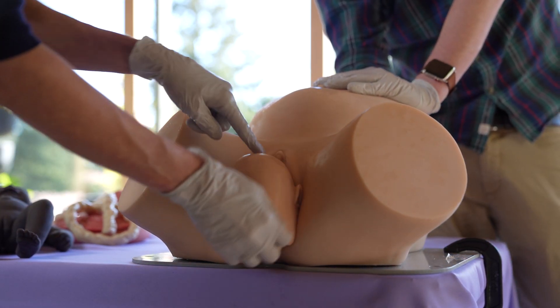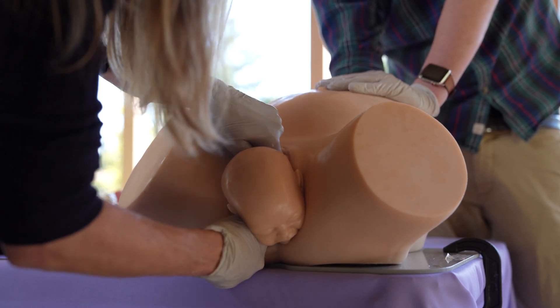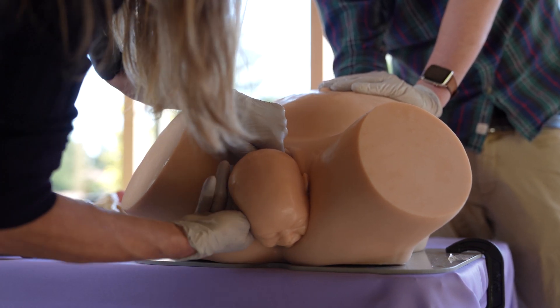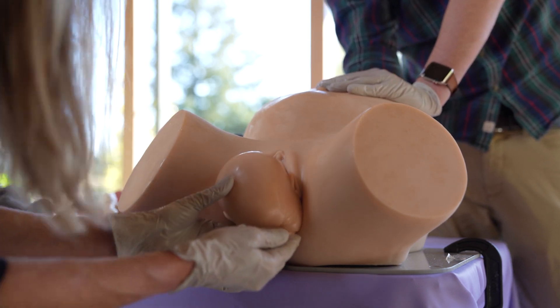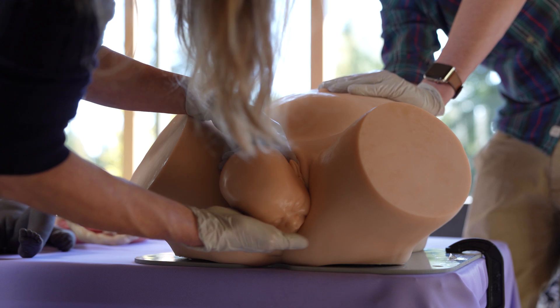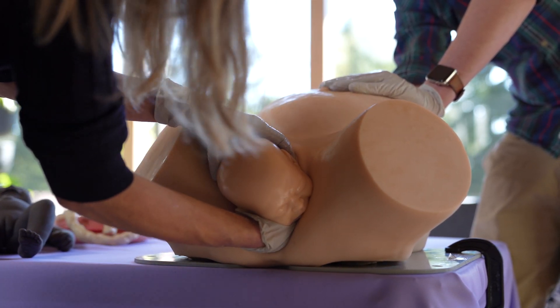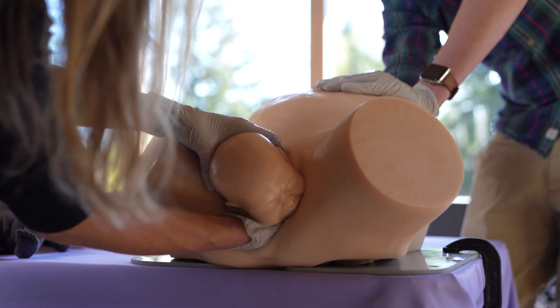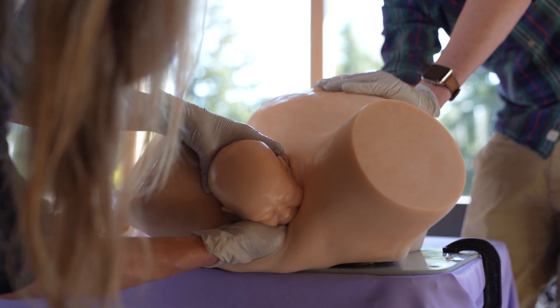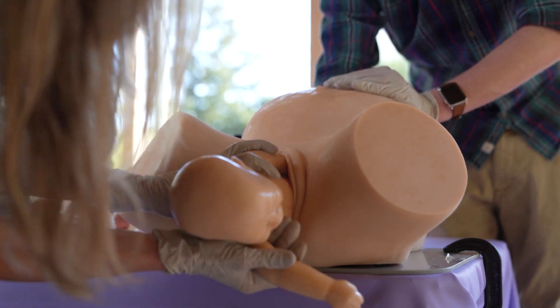I'm going to reach in and try a rotational maneuver — that's not working. Okay, I'm going to go for the posterior arm. Mama, you're going to feel some pressure here. And now we have the little baby delivered.